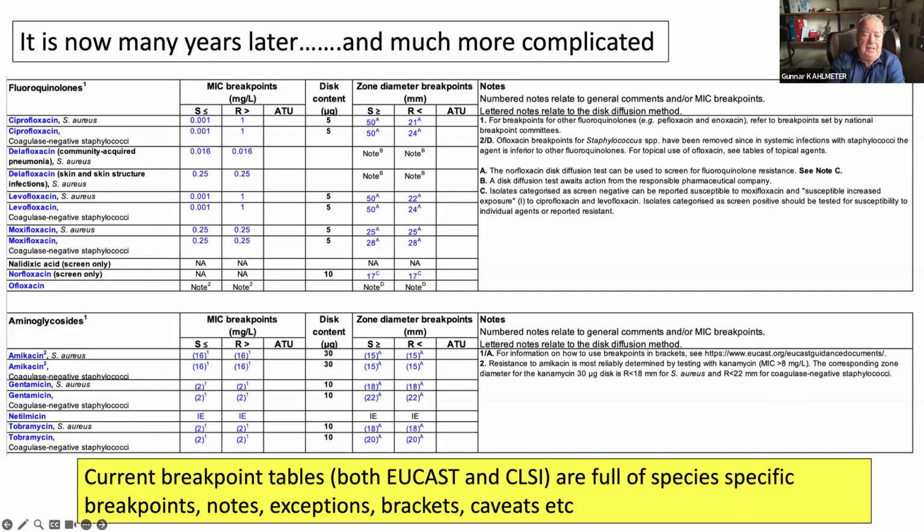Now, many years later, it's much more complicated, not only with EUCAST, but also with CLSI. And this table happens to be a EUCAST table. It could almost also be a CLSI table, lots of footnotes, different breakpoints for community-acquired pneumonia as compared to, let's say, bloodstream infections, etc. And that has made susceptibility testing more complicated than it was.